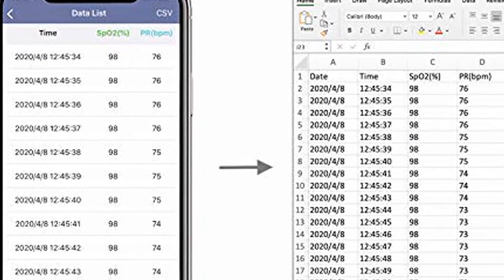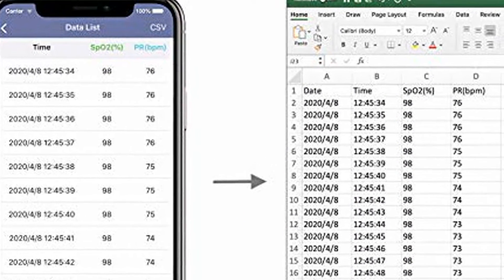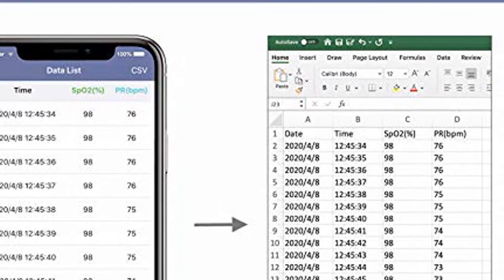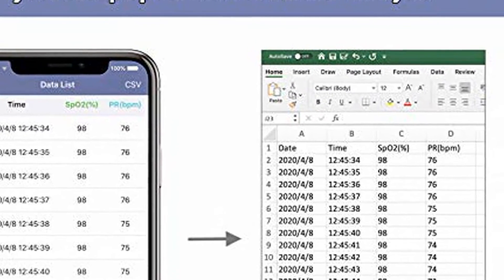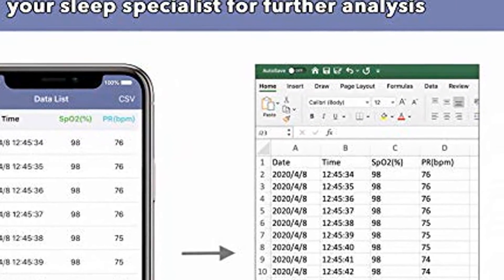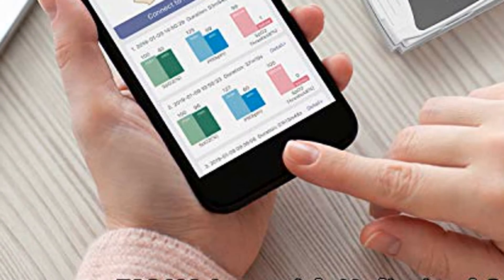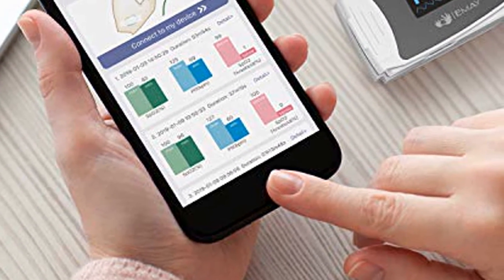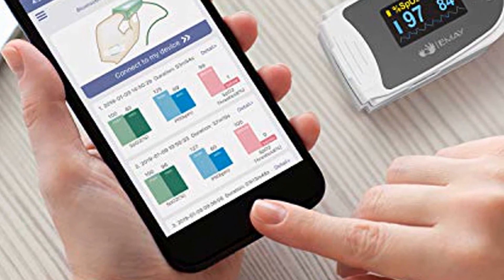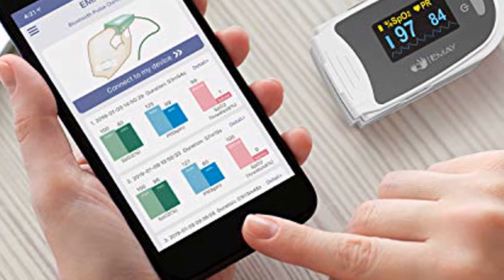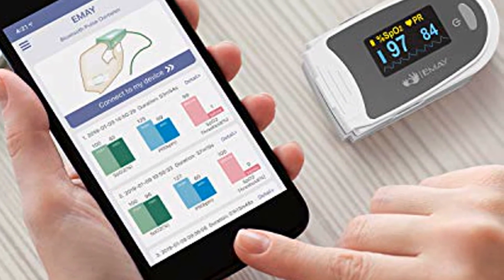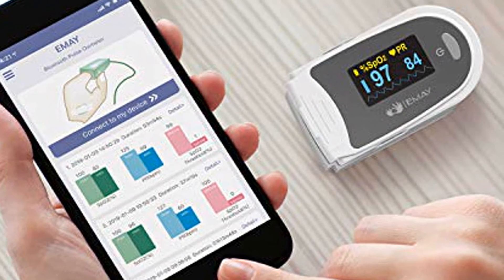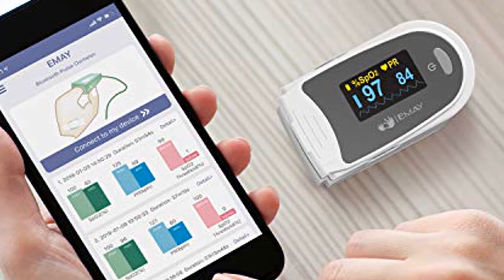MA Sleep Oxygen Monitor allows you to store overnight and continuous blood oxygen saturation levels and heart rate during sleep or other occasions. Record first, sync later — does not require a real-time connection to smartphone. Wear it to record, take it off to sync later whenever you want.